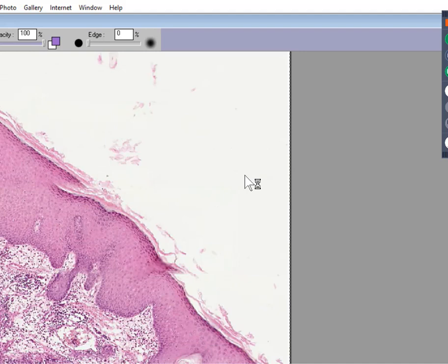We have a stratum corneum, we have a stratum germinativum, we have the prickle cell layer, or the stratum spinosum, we have a stratum granulosum, or those granules. So we're dealing with skin. And you know that anything that is keratinized stratified squamous epithelium with skin appendages has to be skin.